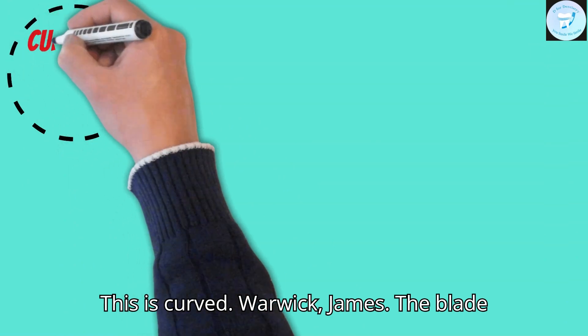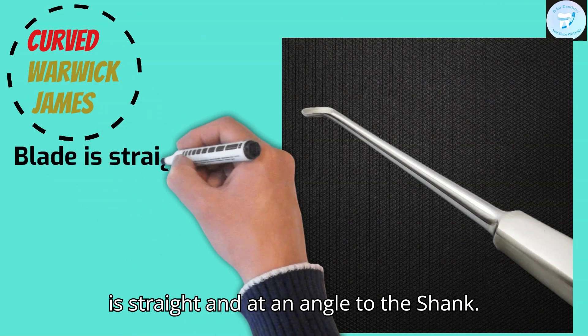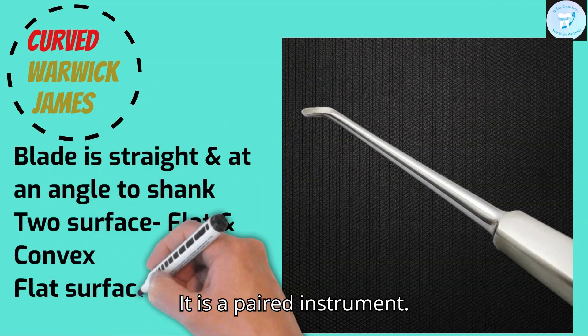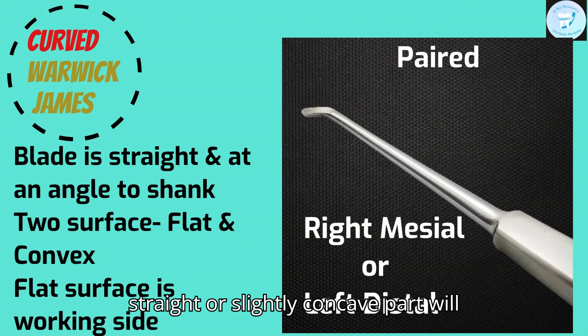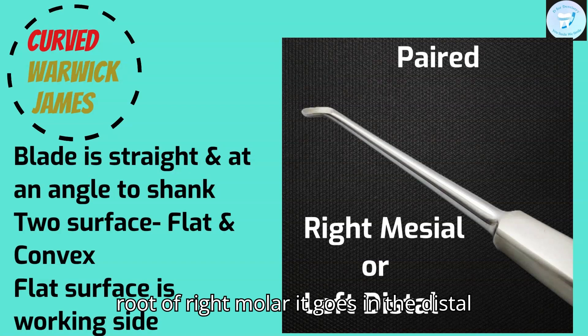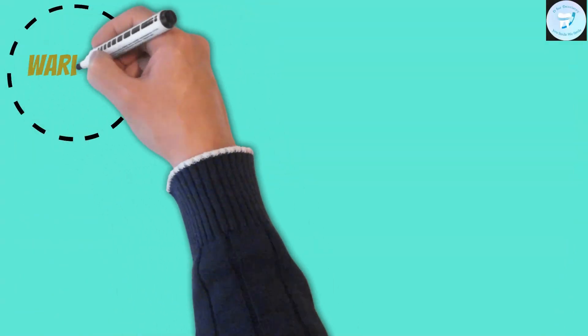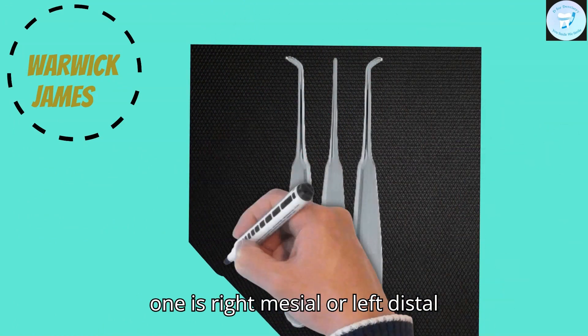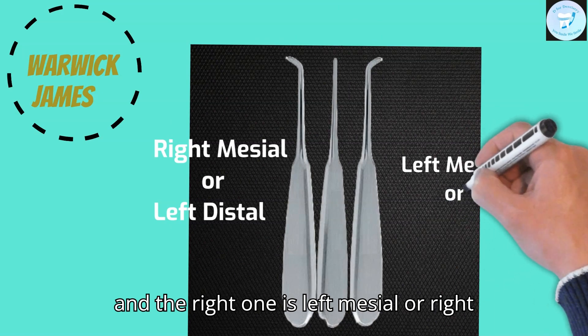This is the curved Warwick James. The blade is straight and at an angle to the shank. It is a paired instrument. The straight or slightly concave part will face the root. So for elevating the mesial root of the right molar, it goes in the distal socket — this is the right mesial or left distal elevator. In this picture, the left one is right mesial or left distal, and the right one is left mesial or right distal.